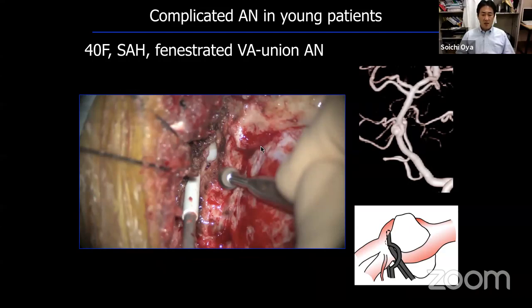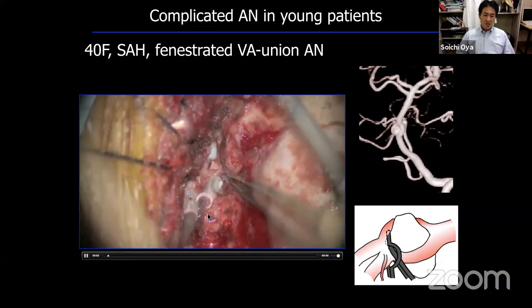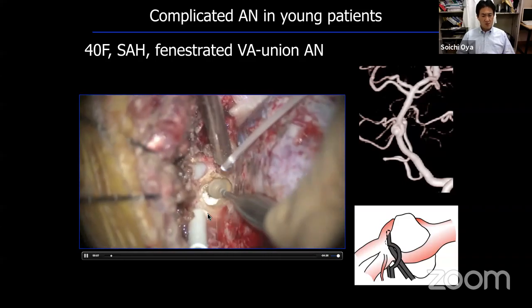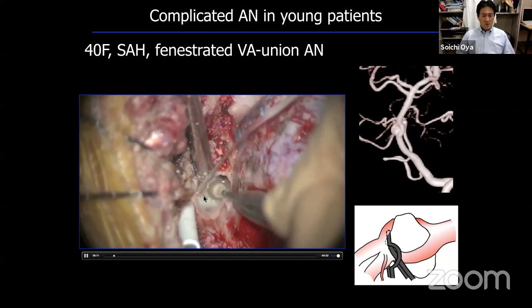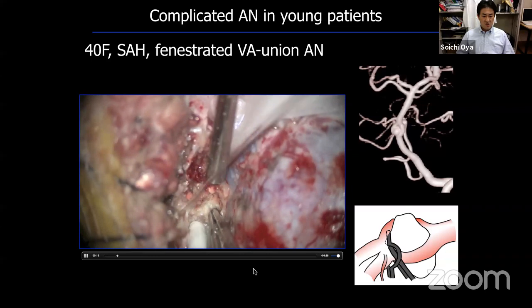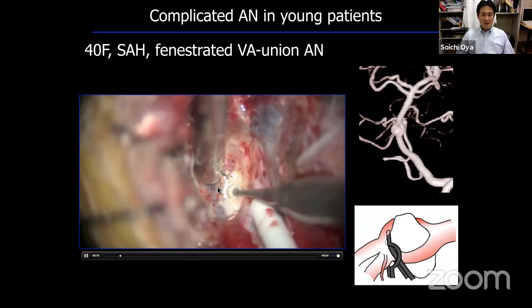consisting of a combined transpetrosal approach. Combined means the combination of the transcondylar approach and the posterior transpetrosal approach. So this is the condyle. And then I am removing the root of the condyle. And this is the condylar emissary vein, which was nicely controlled. This is the hypoglossal canal.